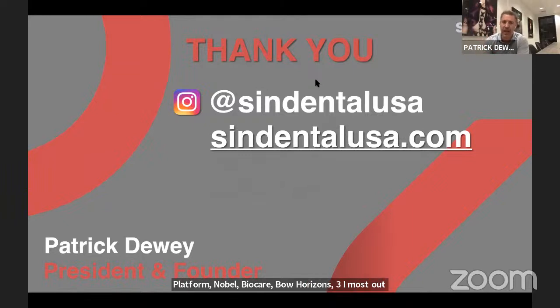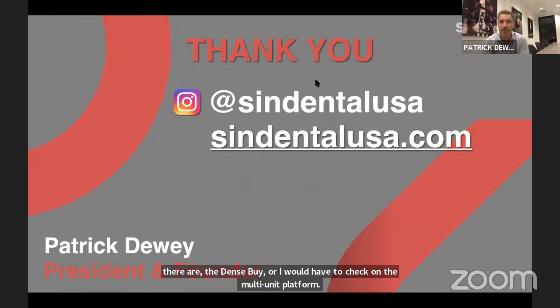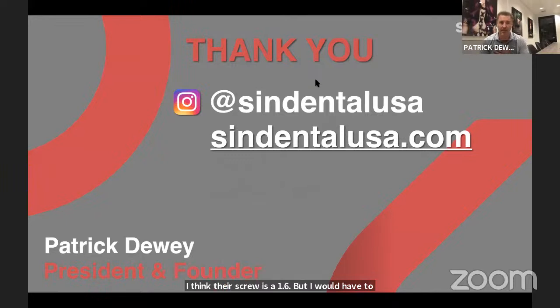The Dentsply Astra, I would have to check on the multi-unit platform. I think their screw is a 1.6, but I would have to verify. I'm not 100% sure on the Dentsply Astra multi-unit. It's been a while. I would check if it's a 4.8 platform with a 1.4 screw, it will work, no questions asked. Even if you're still using Dentsply Astra implants, if for some reason their multi-units are not compatible, Dess offers a multi-unit that fits all implants, including Astra, that has a 4.8 multi-unit platform as well. That's probably the most common standard platform on the market.